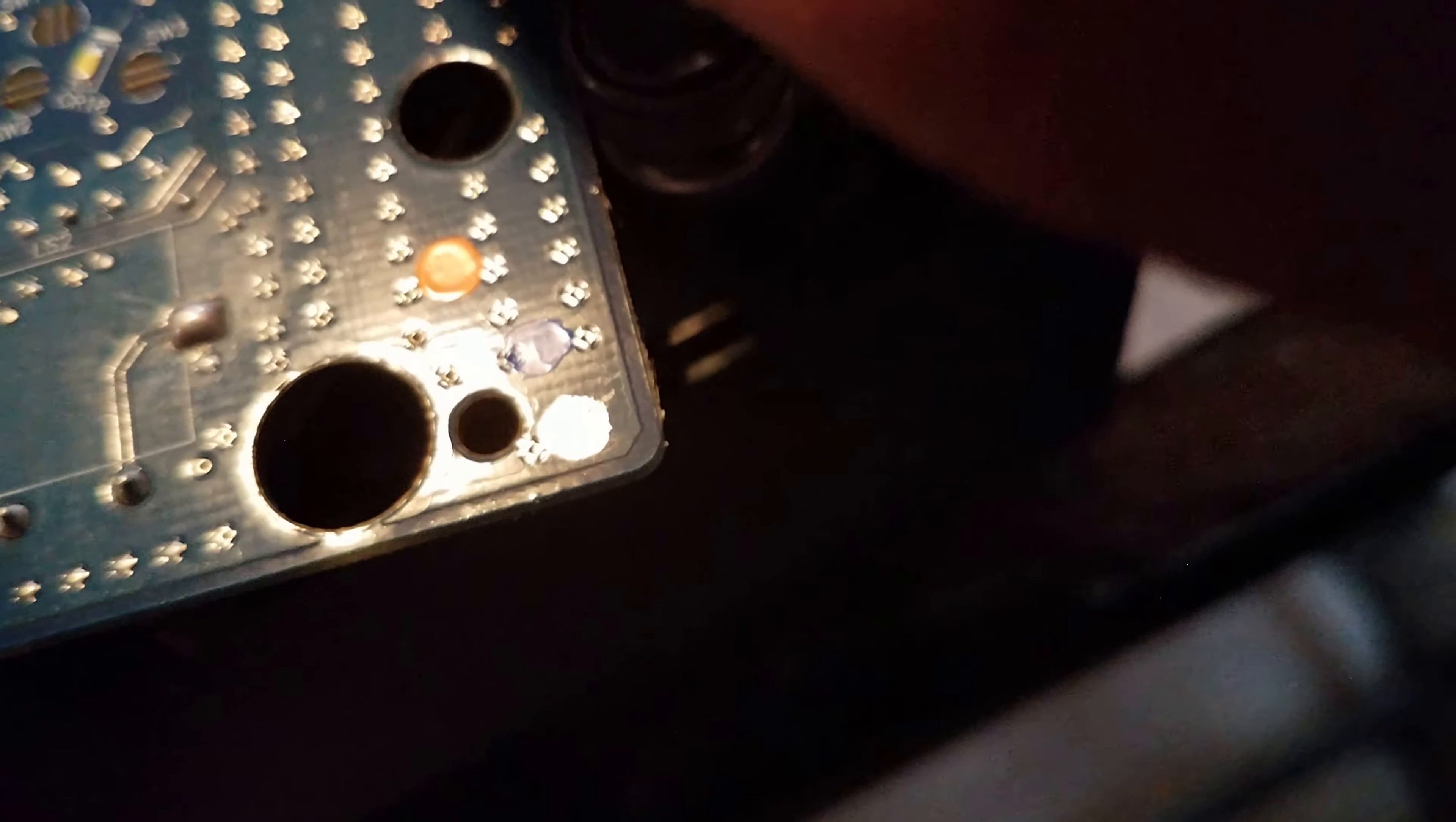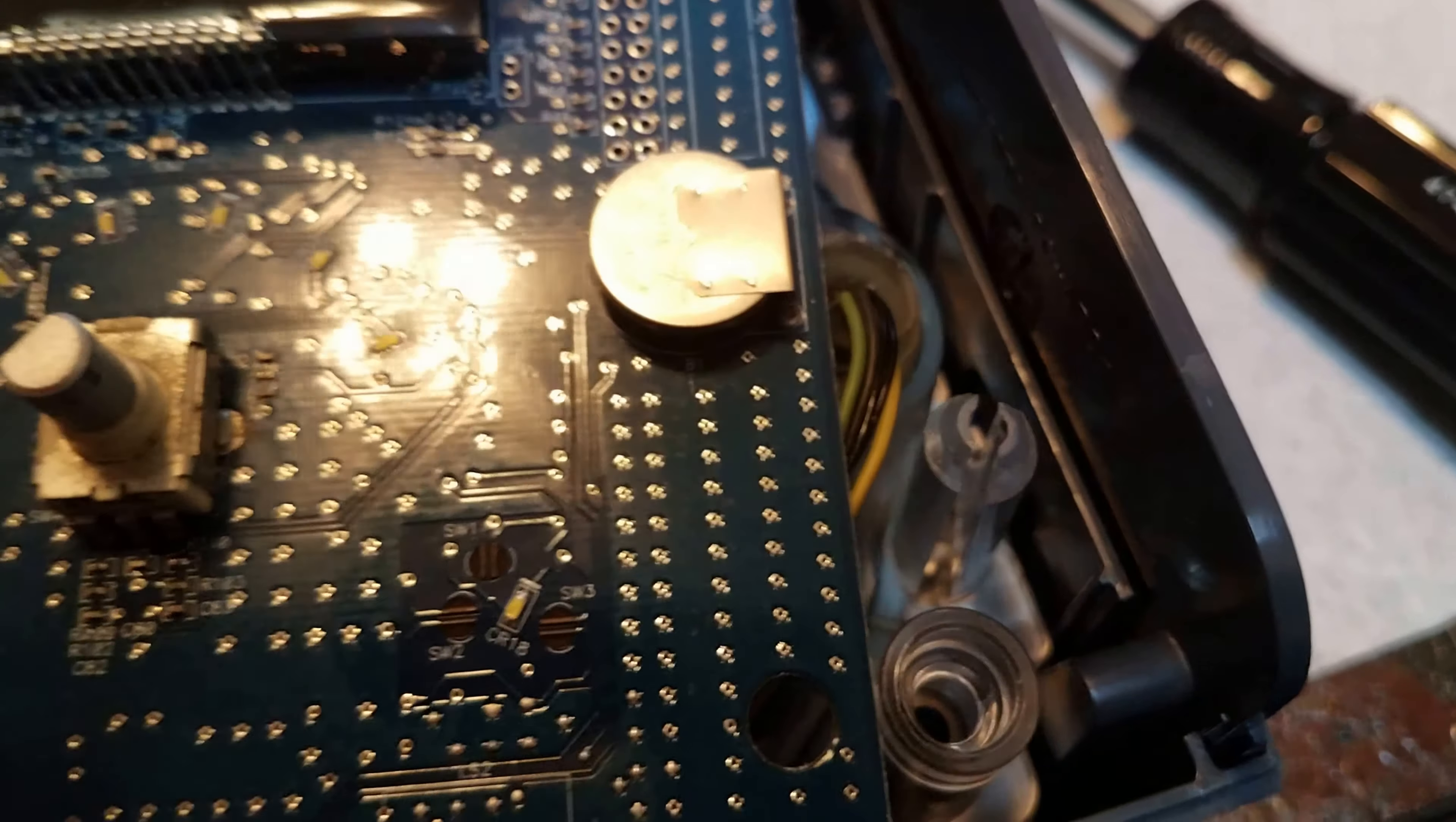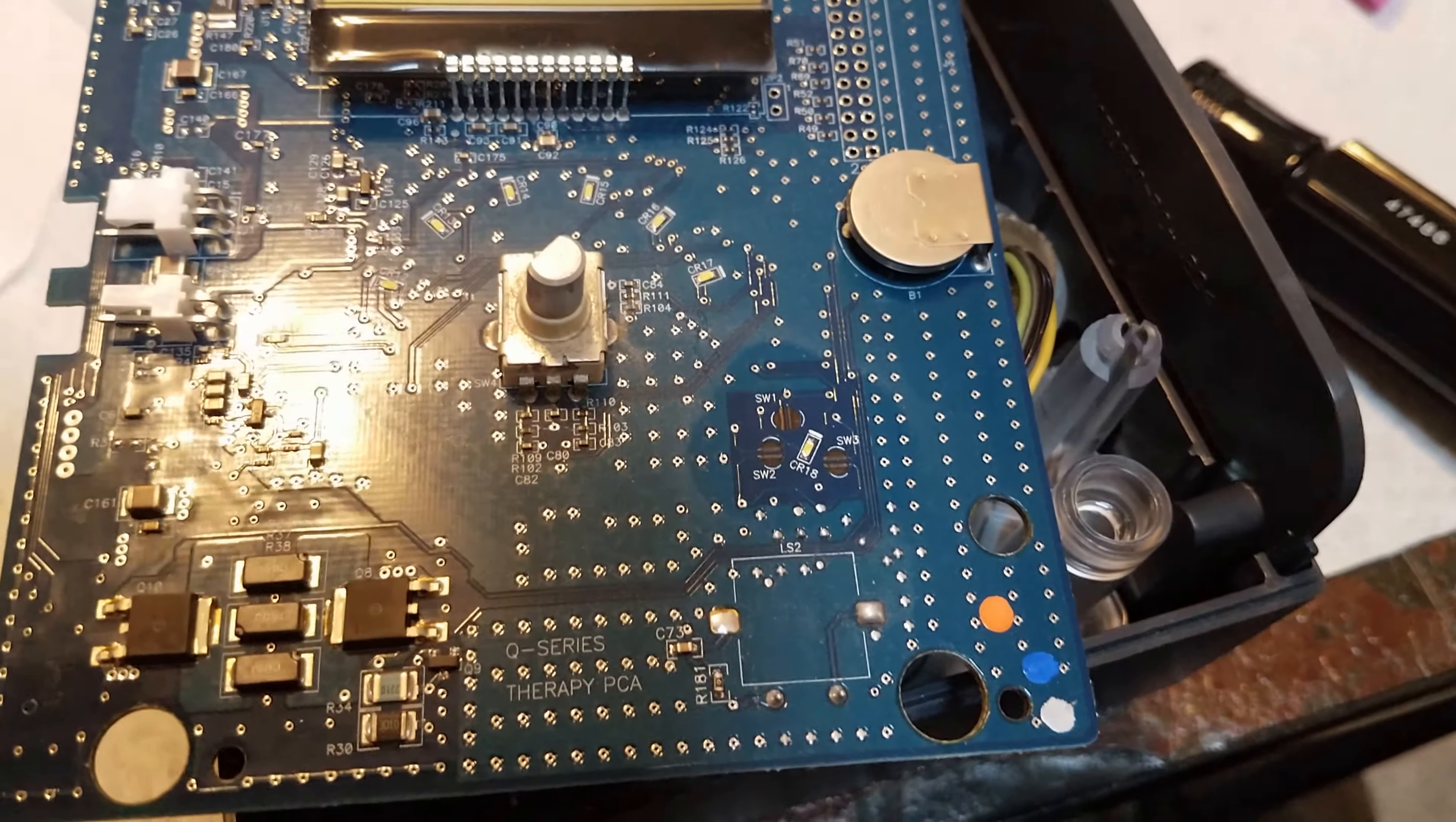I don't see the number on it. I can't spin it, I don't want to mess with it too much. It may be even soldered to the board, as far as I know. That should be able to be replaced easily if someone needs to replace that. Just take it into any TV shop and they can change that out for you.